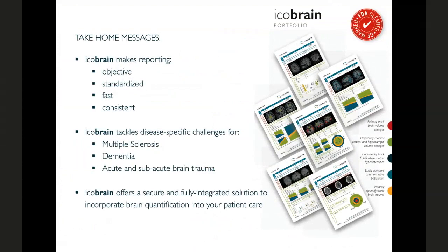That brings us to the end of our presentation, and these are very briefly the take-home messages. I really hope that through this presentation I was able to demystify some of icobrain's core benefits and highlight our disease-specific approach.